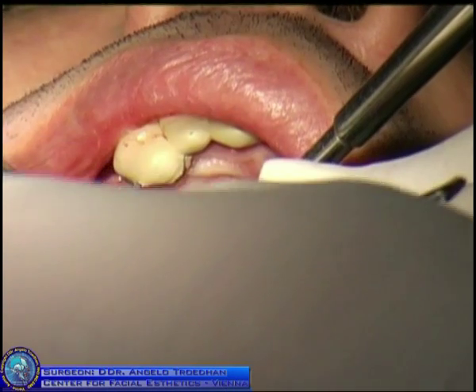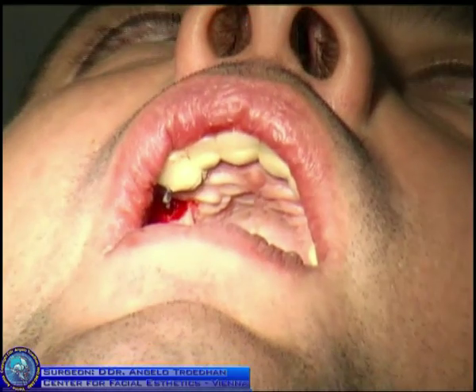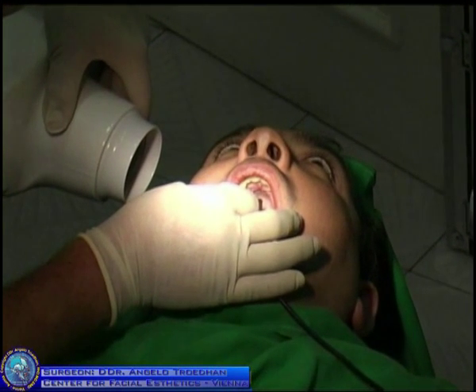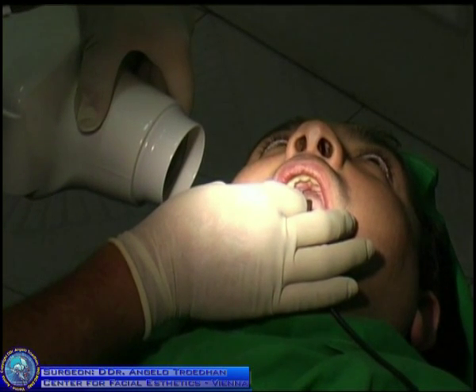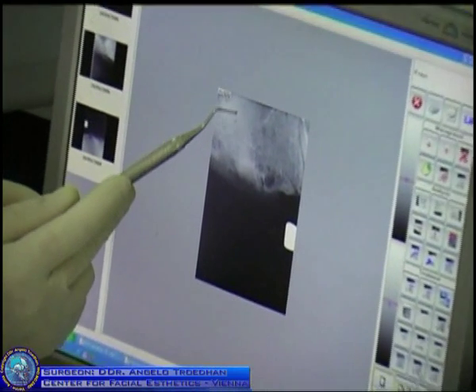So now we are done with the bone, and if we are lucky, we can make now a control X-ray. So I'll try to get the X-ray exactly rectangular, but I can't promise if I succeed because it's not mine. Okay. So, unfortunately, you have to simply believe me, because what I can see on the X-ray here is really a big half ball, approximately.